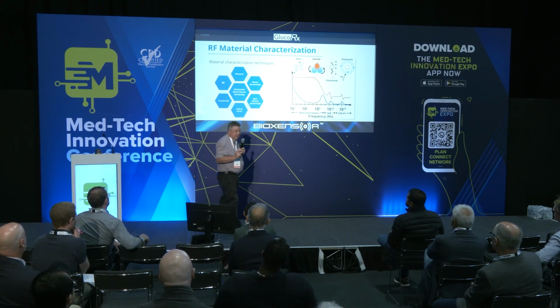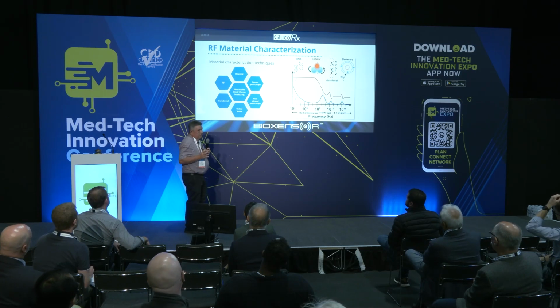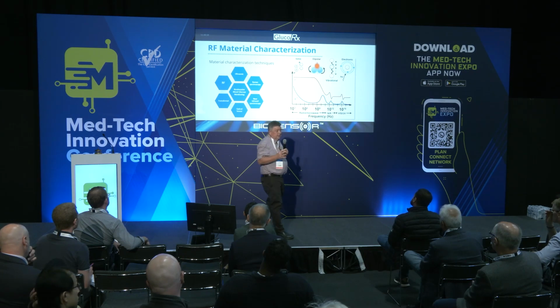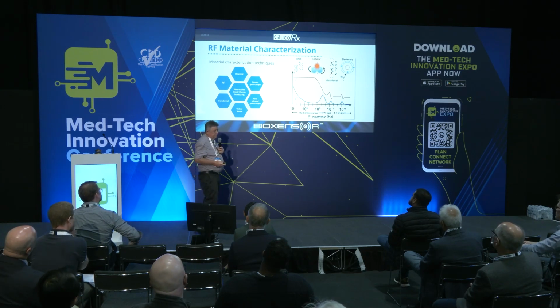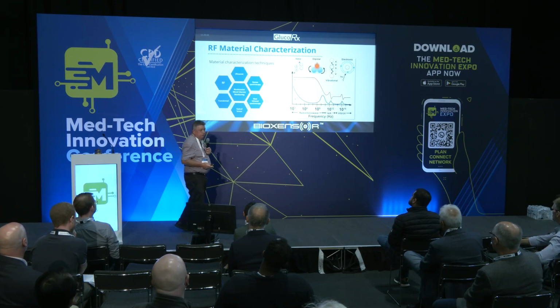But it's a trace, it's a needle in a haystack, this. It's not something that's easy to extract. So we've got to get the electronics right. So we're looking at rotations of water molecules and the disruption of that from other species, such as glucose. Very good question is, how specific is it to glucose? I'll come back to that in a bit, because it isn't specific to glucose, but that's why we have to have other sensing technologies on board as well, and that's really important. So the RF method is going to give us some information, the primary information, but it's not going to tell us the whole story. So we need a multi-sensor approach here.